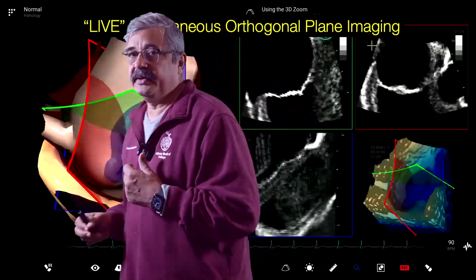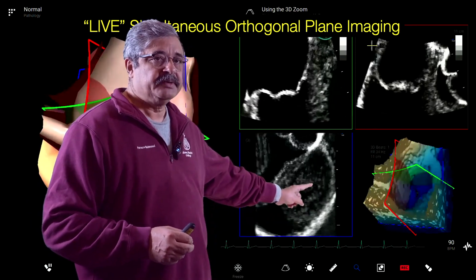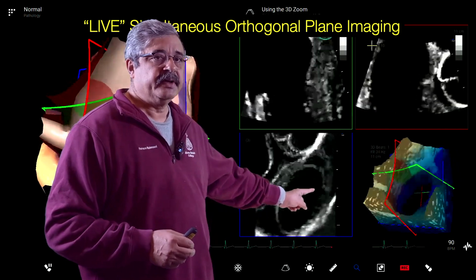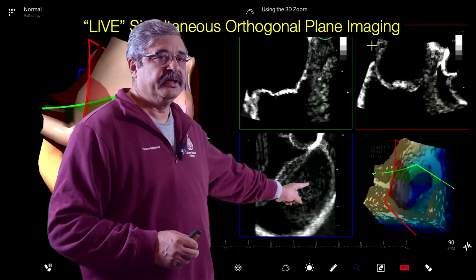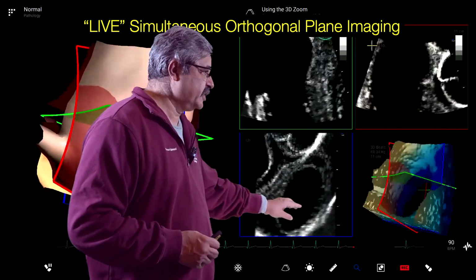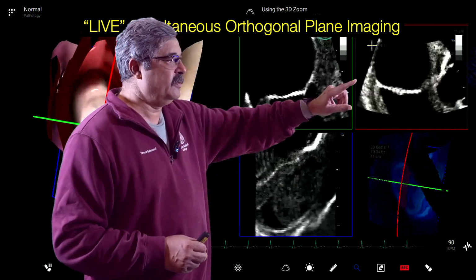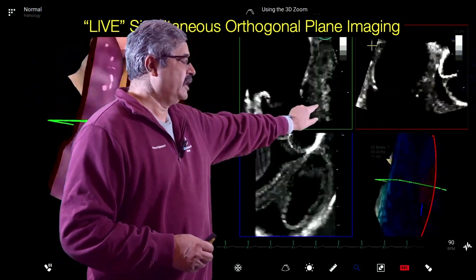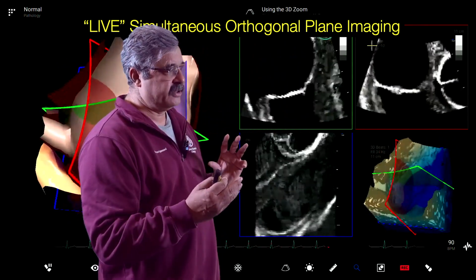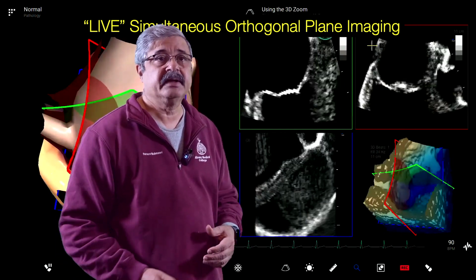The one on the right side gives us this opportunity. For example, this being the anterior leaflet, this being the septal leaflet, this being the posterior leaflet, you can position, based on these leaflets, where the edge-to-edge device needs to be positioned. And once you position the device in this specific frame, you can confirm the position based on the multiplanar frame. So essentially, you're looking at two orthogonal planes at the same time and trying to see whether the device has been positioned correctly or not.